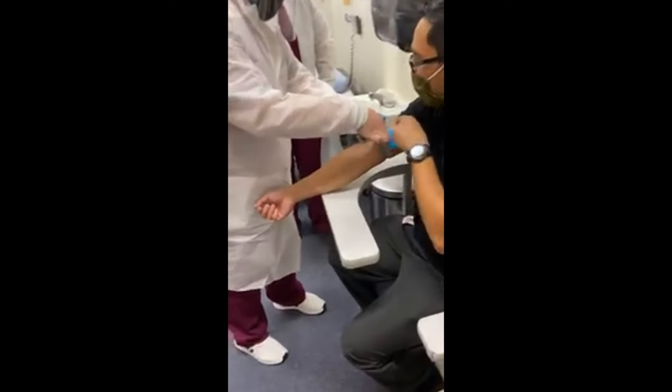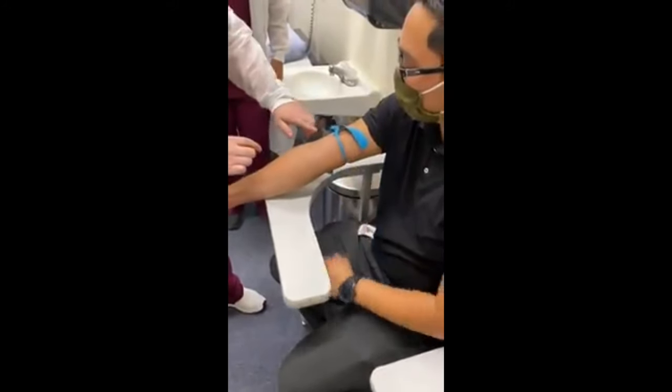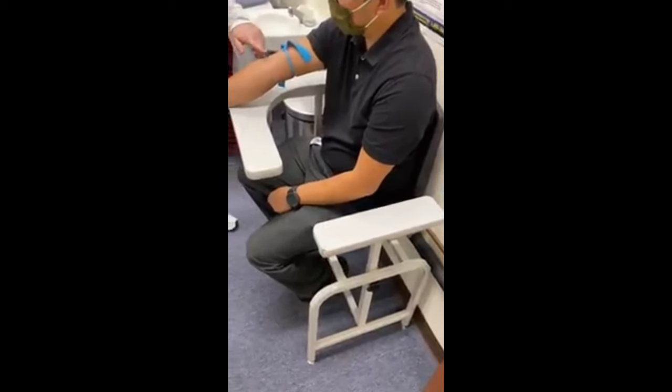Okay, there you go. You'll have the bunny ears. And like that. Good tension right there. And then make it fit. Perfect. And can you feel my vein?